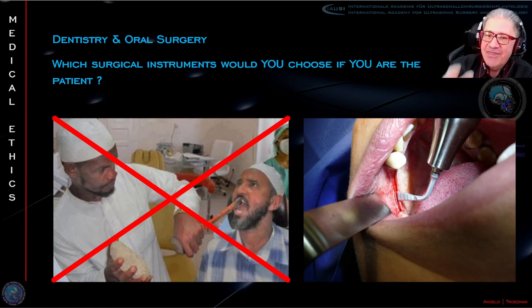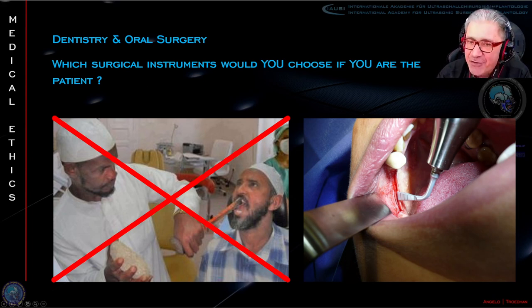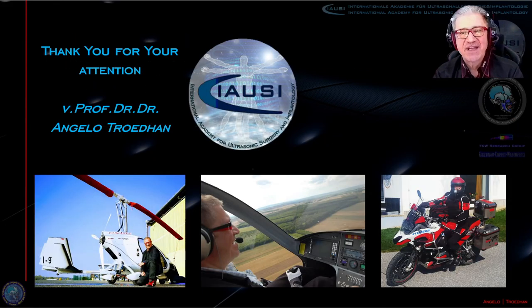Because first of all, the success rate is significantly higher on one hand, and on the other hand, the pain load and the morbidity after the surgery is more than 50% less with piezotome surgical instrumentation. And some surgeries are only possible with piezotomes and are not possible with rotary instruments.